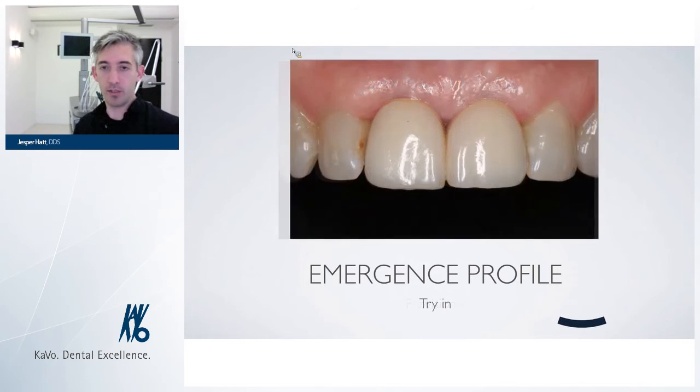And here we have the trying of the final prosthesis. As you can see, the technician here is able to kind of pressure the soft tissue into position. Is the soft tissue perfect? No, it's not. And at the moment we did this, it was before we knew anything about how we could manage the soft tissue appropriately.